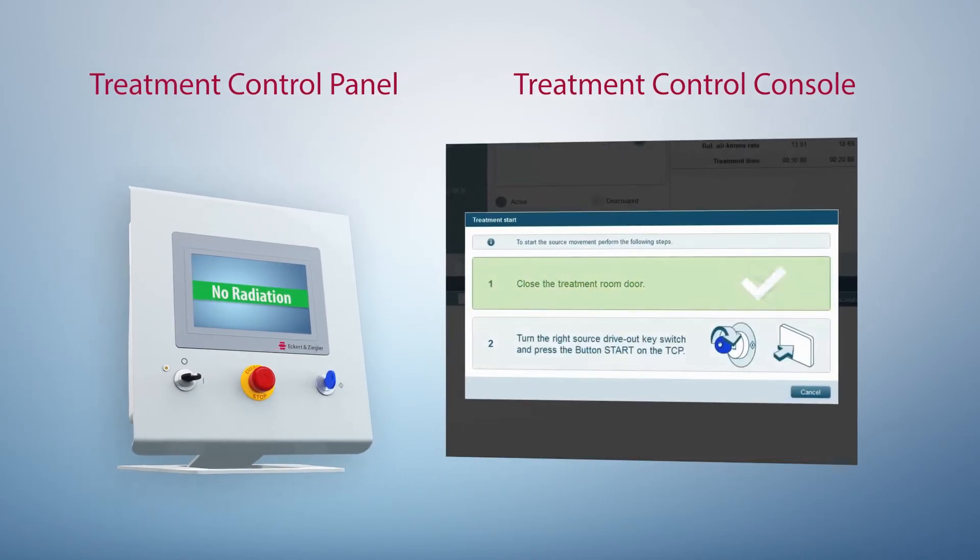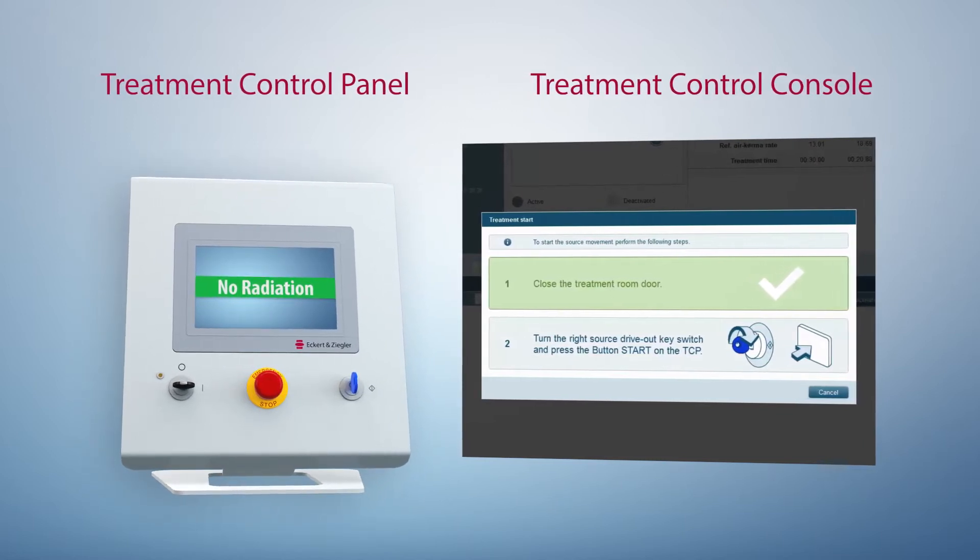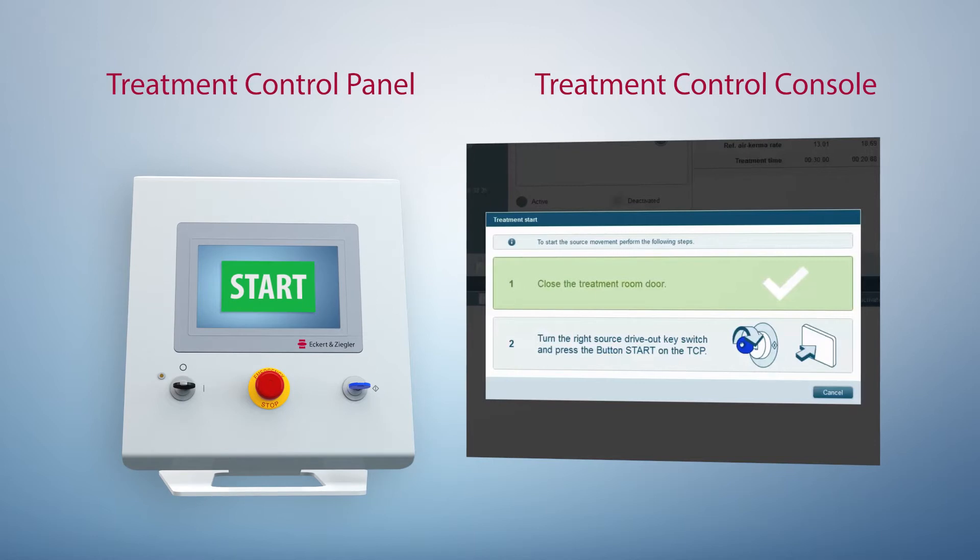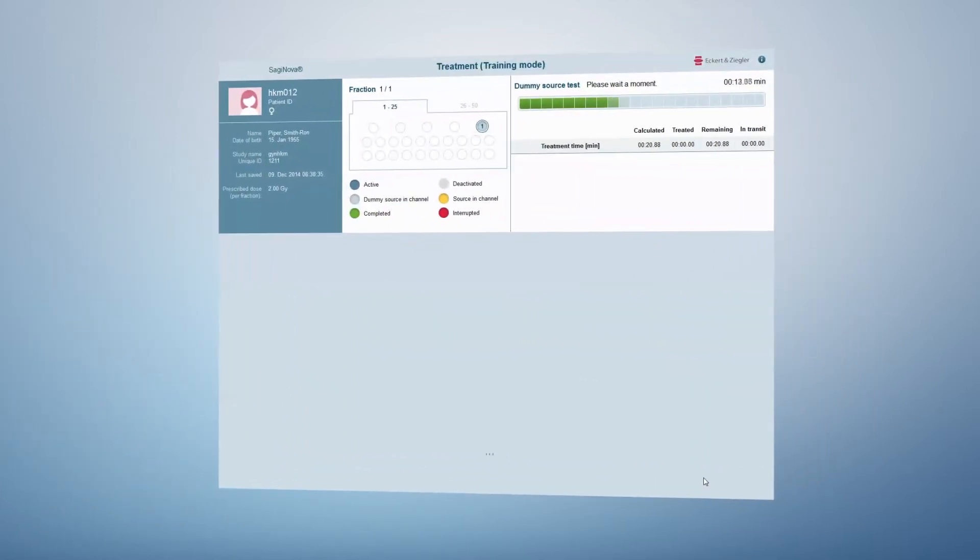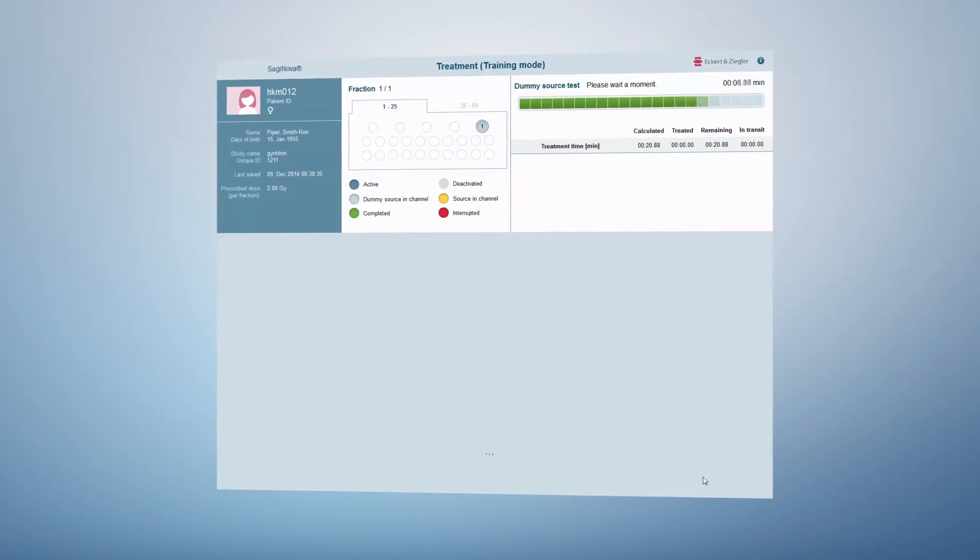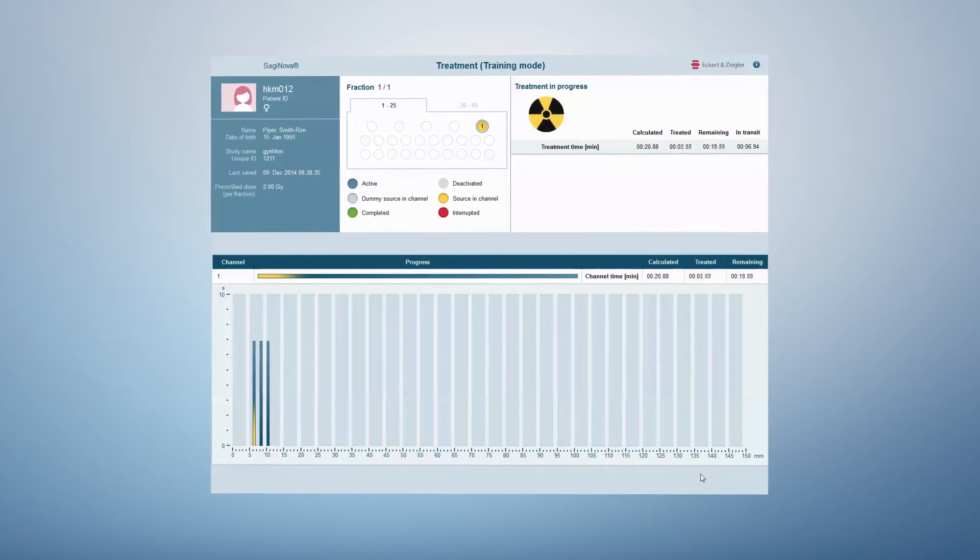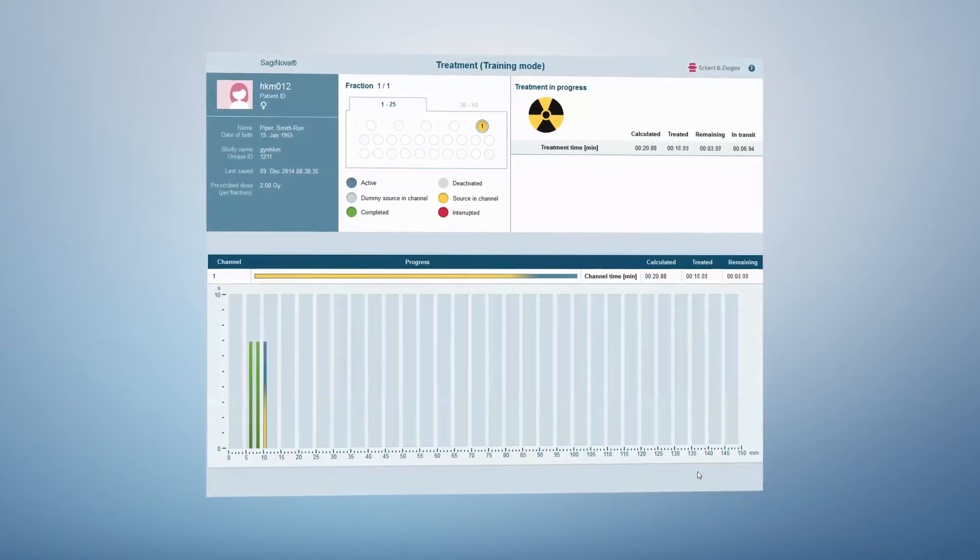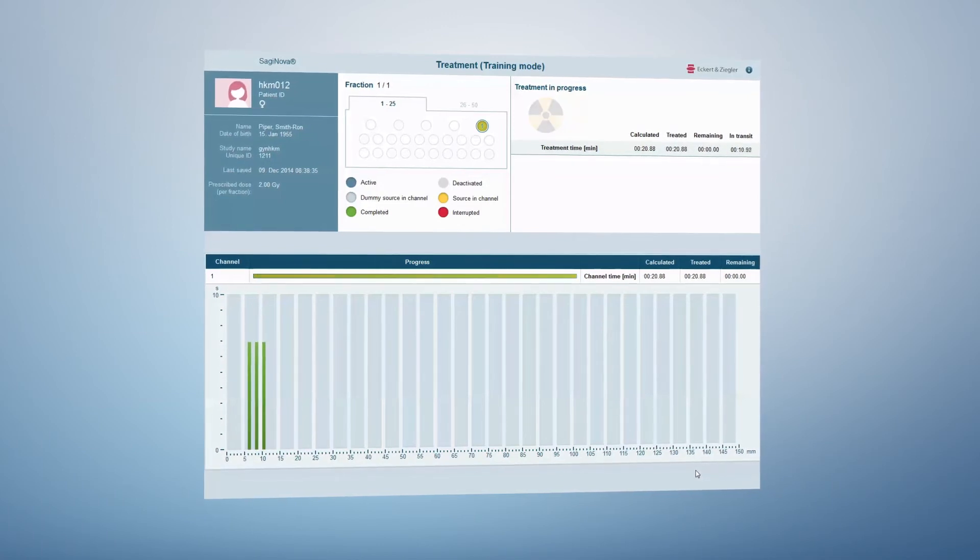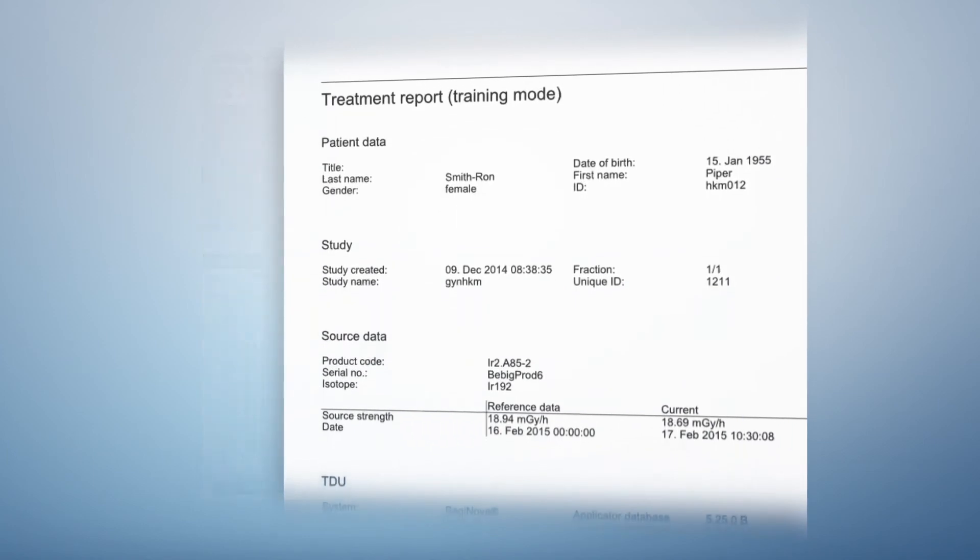The new Saginova graphical user interface was developed in cooperation with brachytherapy experts and usability engineers, leading to the development of the next level of smooth and efficient workflow guidance. The treatment status is continuously visualized in different colors. All important information is available at a glance. The corresponding report is just one click away.